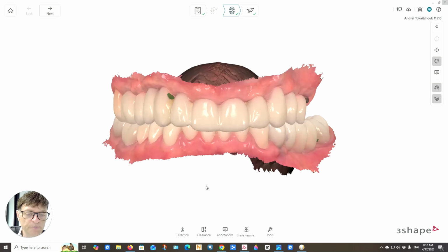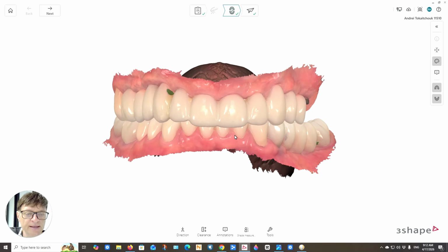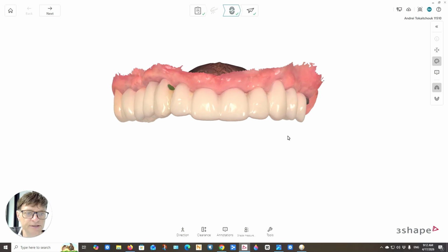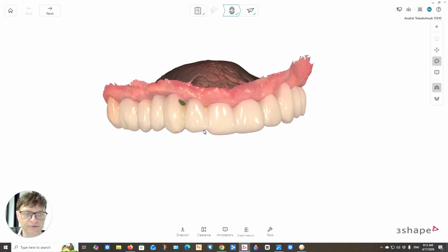So after the implants are placed, we put some temporary bridges. This is what the temporaries look like. So he never ever had a gap, he never ever had dentures. He had a fixed bridge all the way through while he was waiting for the bone to go into the implants to integrate. It took about 3-4 months, plus some bone grafting, which took another 4-5 months. And so the procedure took quite a while, but in all the time he had these temporary teeth in place.